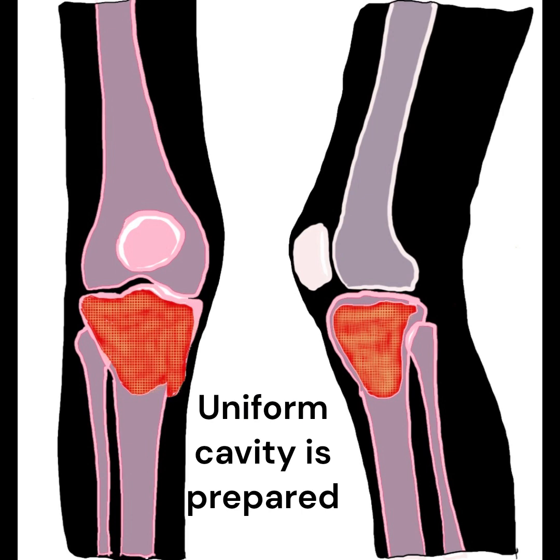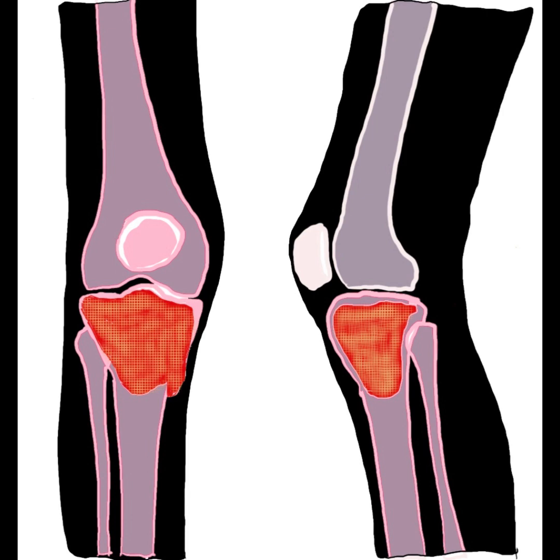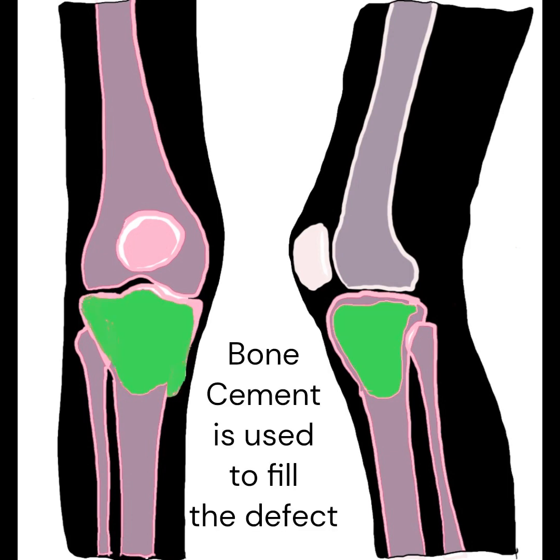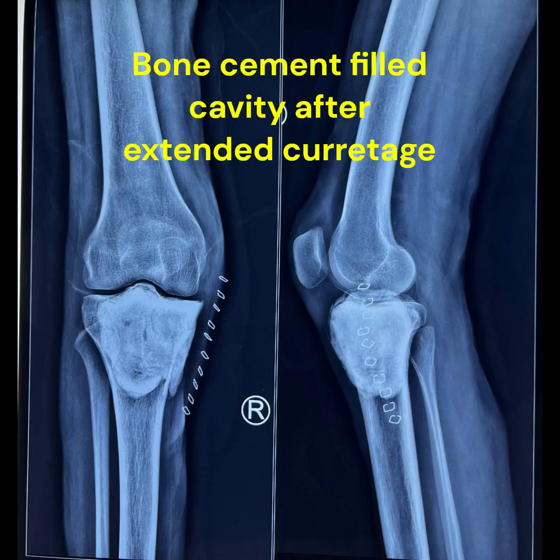After the extended curettage, the resulting bone cavity must be filled to provide structural stability. Polymethylmethacrylate (PMMA) bone cement is used to fill the cavity. Bone cement not only fills the void but also generates heat as it sets, which further helps to destroy any remaining tumor cells — a process known as thermal necrosis.